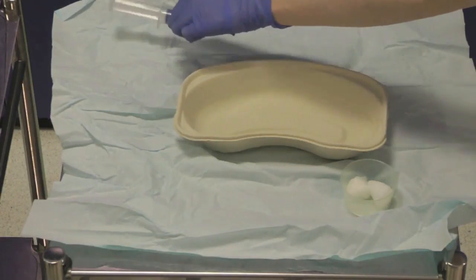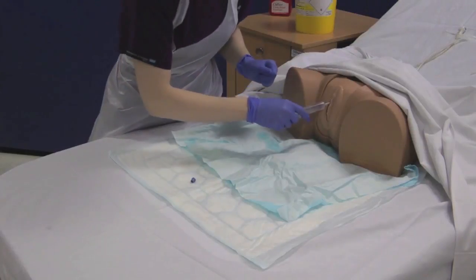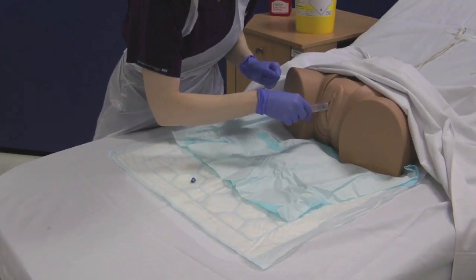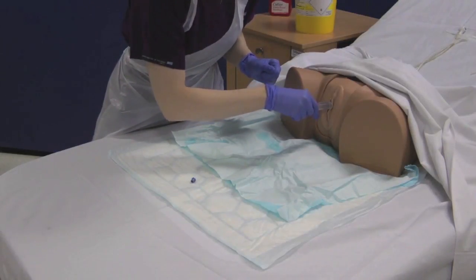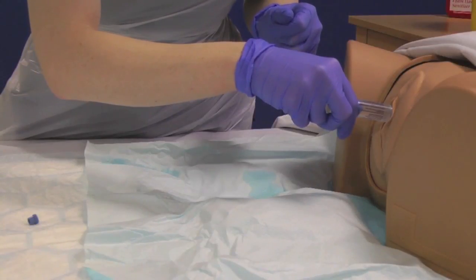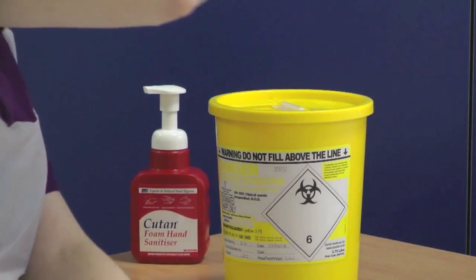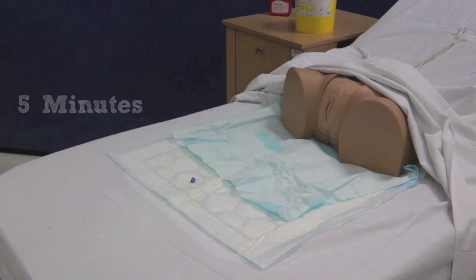Once you have finished cleaning the genitalia, take your Instillagel and insert only 6 millilitres into the urethra. Dispose of the syringe into the sharps bin. Allow 5 minutes for the gel to take effect.